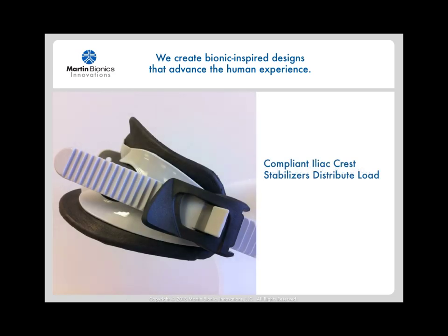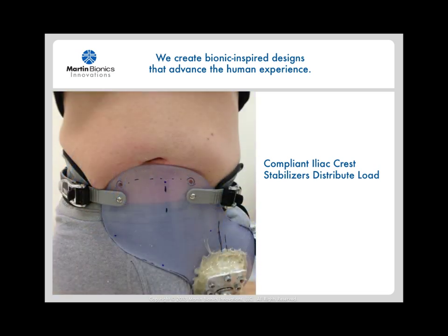Instead of wrapping the entire heavy and bulky mass of the socket all the way around the user, this design replaces the majority of the socket with lightweight, compliant, and adjustable iliac crest stabilizers. These sections contour over the iliac crests or hip bones and help suspend the prosthesis by distributing the forces through soft and compliant materials. The iliac crest stabilizers are fully user-adjustable and inherently accommodate for weight gain and loss.